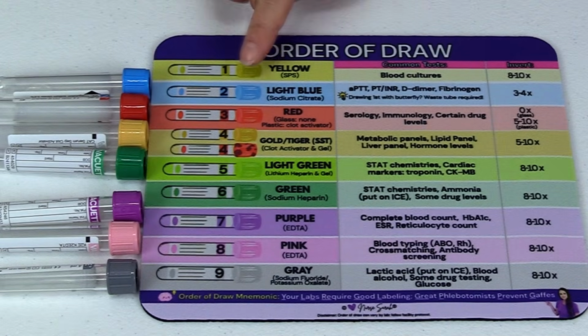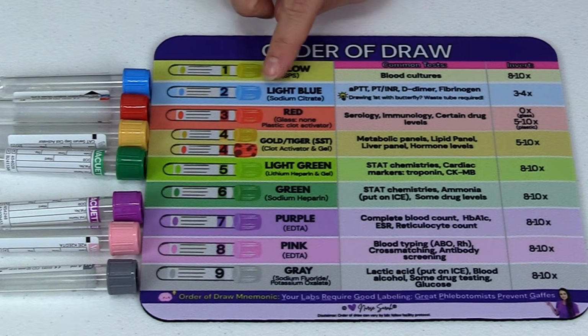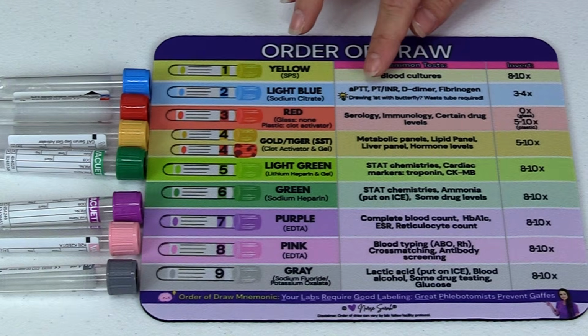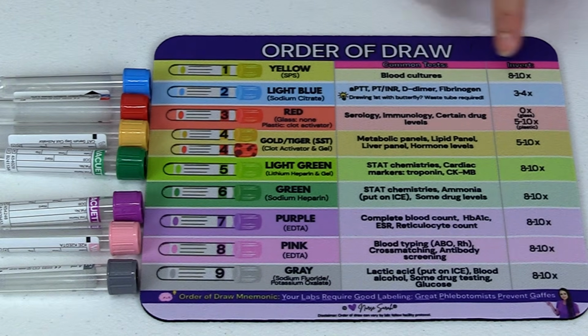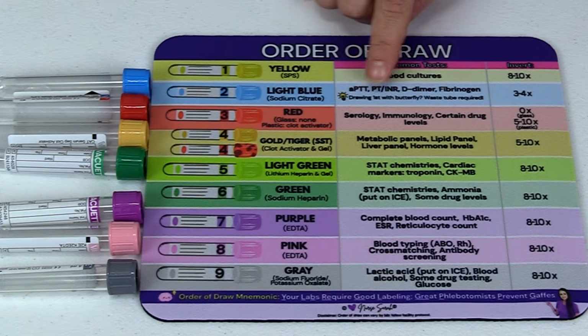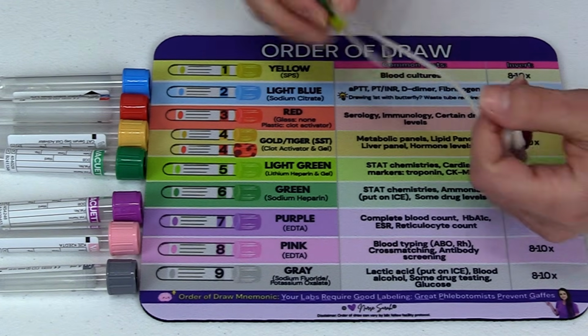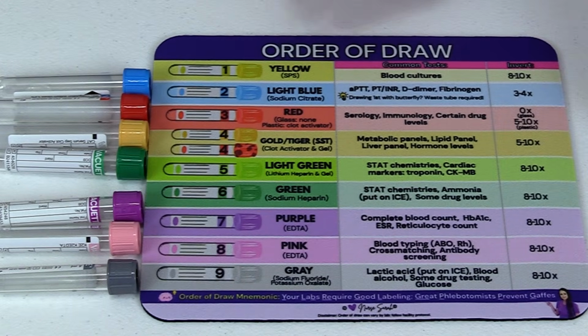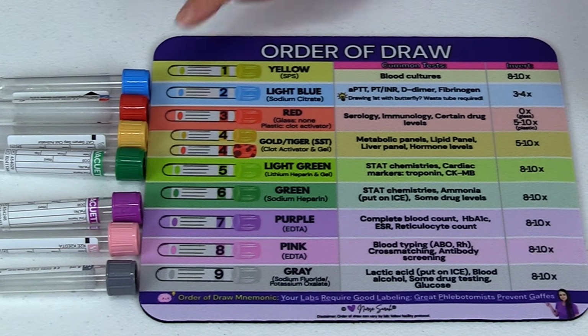After that will be your light blue tube. It has the additive sodium citrate. This is what's going to be in your coagulation studies. The inversion time is about 3 to 4. Now one thing I want to point out about this is this part right here. If you are drawing this first with that butterfly that we talked about earlier, you have to have a waste tube before you pop on that tube.